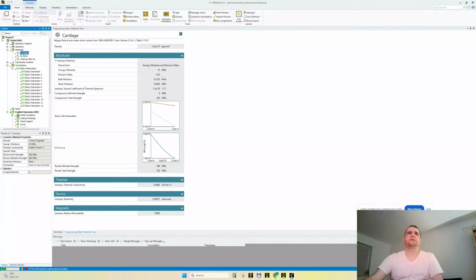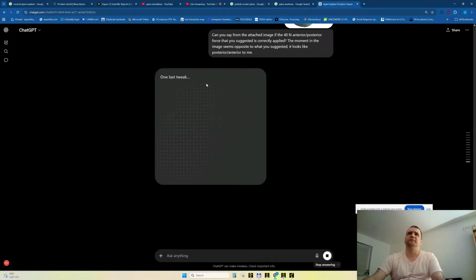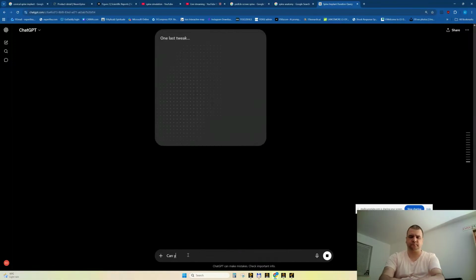What properties do we have here? I have 10 megapascals for Young's modulus. This is much. Look here, didn't finish. Can you estimate Young's modulus for the disc vertebrae? I will say I will help it. Estimate. Come on.